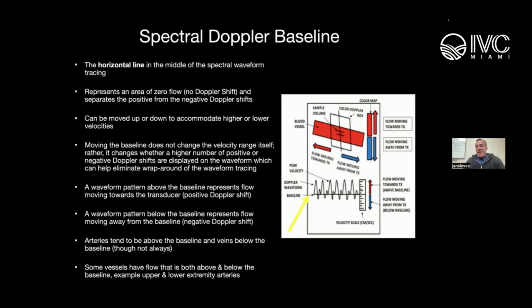Correct. Right. So just to summarize this, the operator needs to be able to change their scale appropriately, and shift the baseline, and also change the speed at which they're acquiring that information so they can measure the entire length and the duration of reflux accurately.